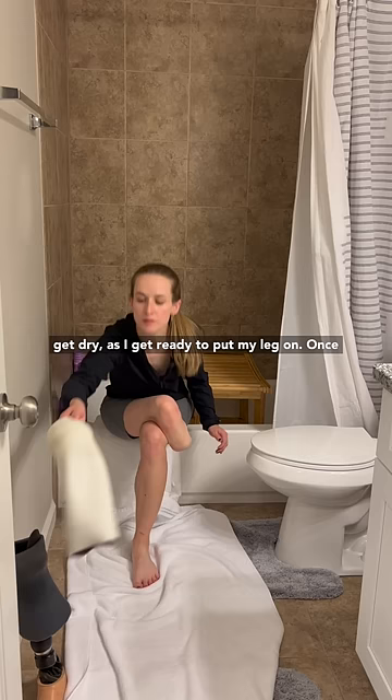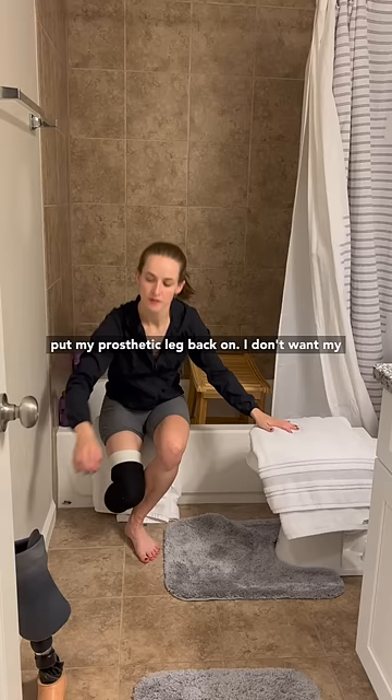Once my leg is dry enough, I go ahead and put my prosthetic leg back on. I don't want my skin to be wet because you don't really want extra moisture in contact with your skin all day. Hang the towels back up, and that's pretty much it — pretty easy modifications for a safe shower.